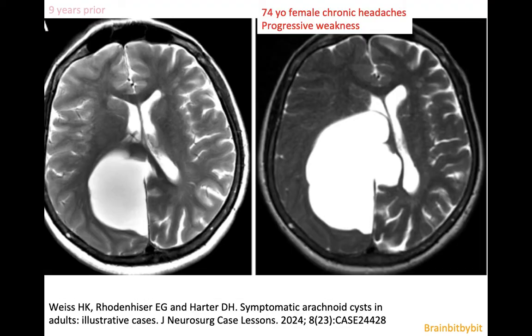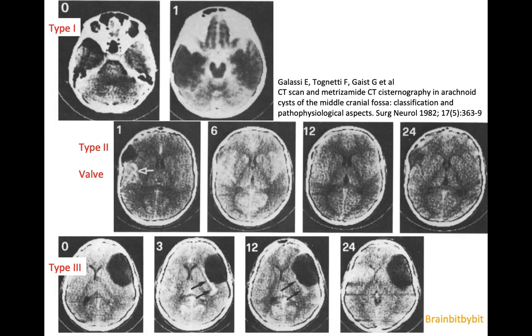Arachnoid cysts can also grow. For example, in this female in her 70s with chronic headaches and progressive left-sided weakness, you can see a very large arachnoid cyst in the right parietal region that was much larger than nine years before. The arachnoid cysts that grow are Galassi type 2 cysts.